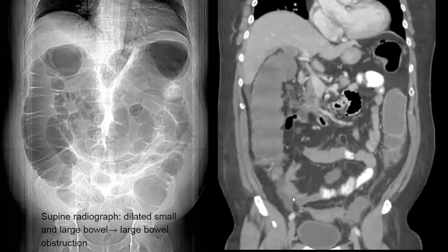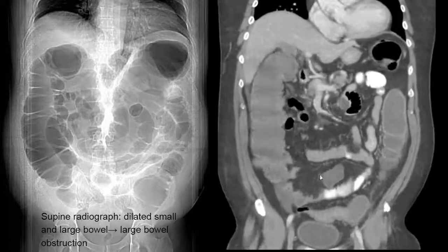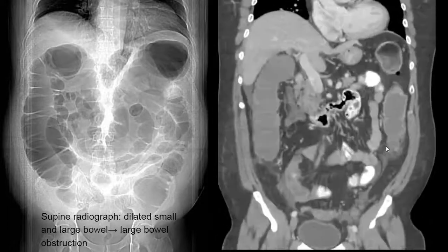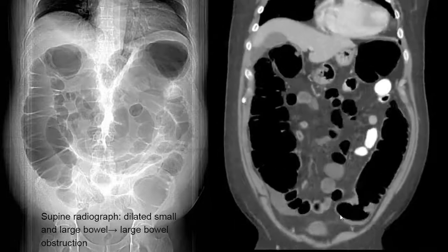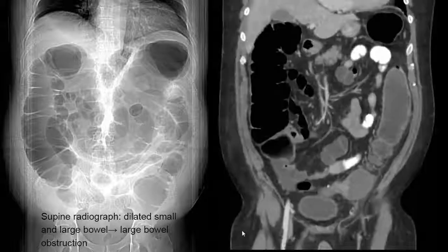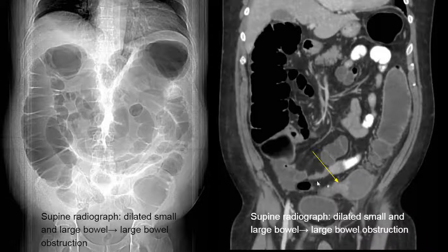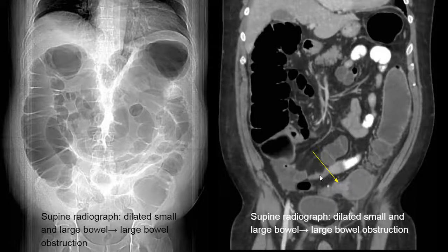The CT abdomen and pelvis for the same patient confirms abnormal dilatation of the ascending and descending colon as well as part of the small bowel. Looking at the distal colon, we can see the level of obstruction. In patients, the most common cause of large bowel obstruction is colon cancer, though other causes include sigmoid diverticulitis. In this patient, colonoscopy revealed focal sigmoid diverticulitis.